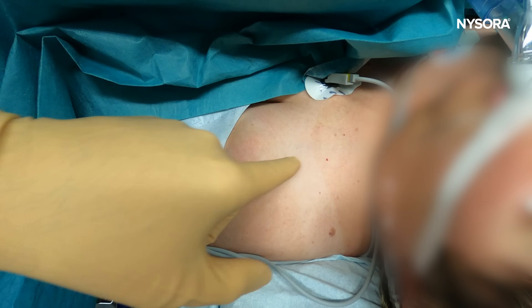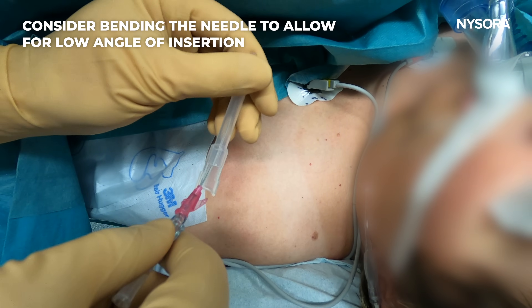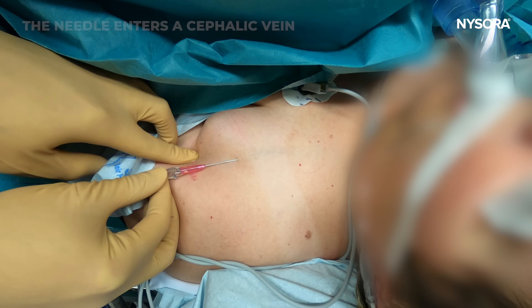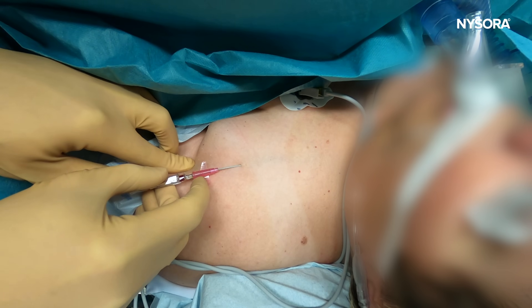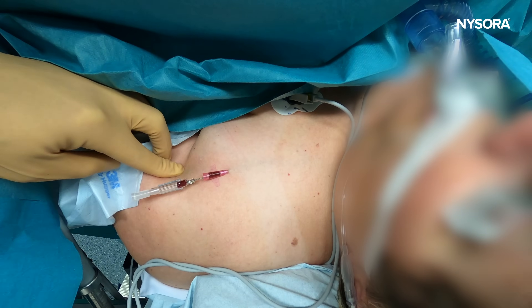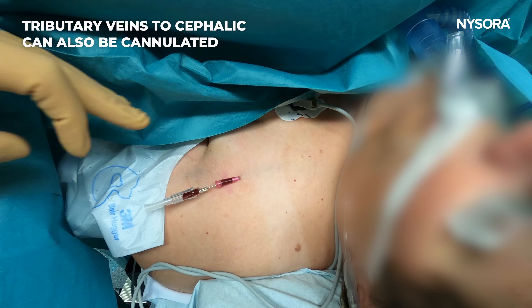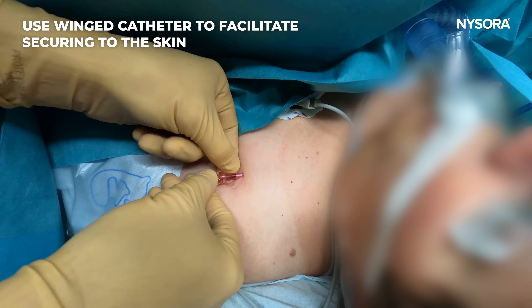That's the vein — you may or may not be able to visualize it easily, but in the absence of any other choices, I'm going to bend the IV slightly, pull the skin, and try to get into the vessel. There we go — we have a flashback right there. Feed the catheter in. That's a good IV. This is a very good option in obese patients — you can always find them on that side, somewhere around the neck or around the axillary fold.